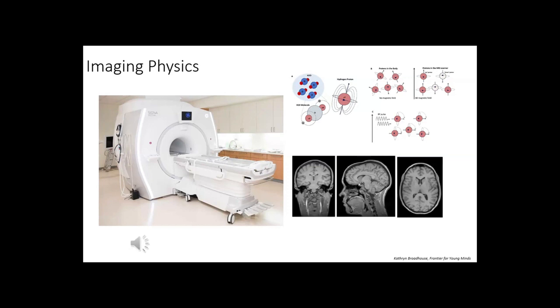But as I mentioned earlier, when you get into the scanner, we put a coil in there. So what is a coil? Basically, we plug in the electricity, so there's electricity all around your head. If you have taken an MR scan, how many of you have taken an MR scan before? Nobody? All right.